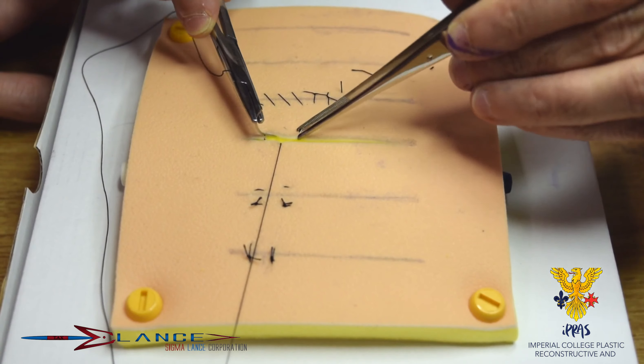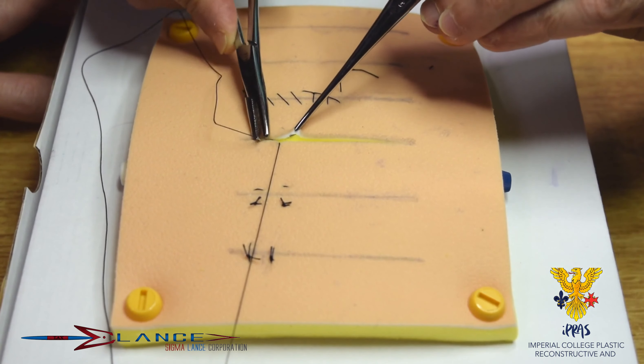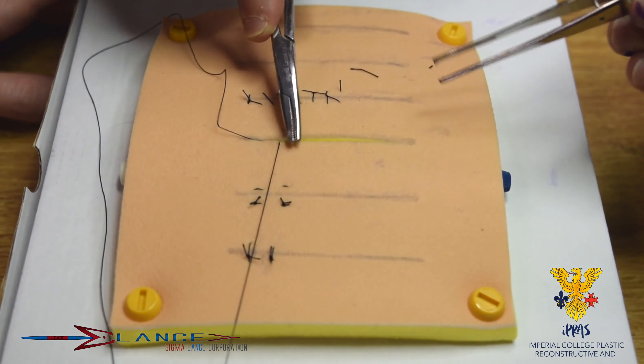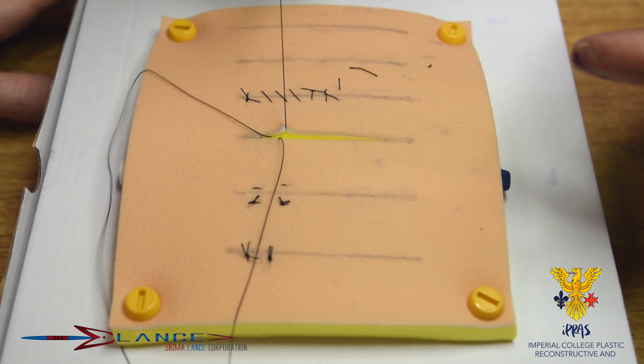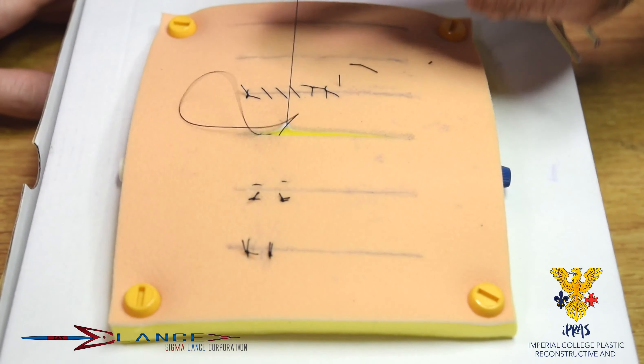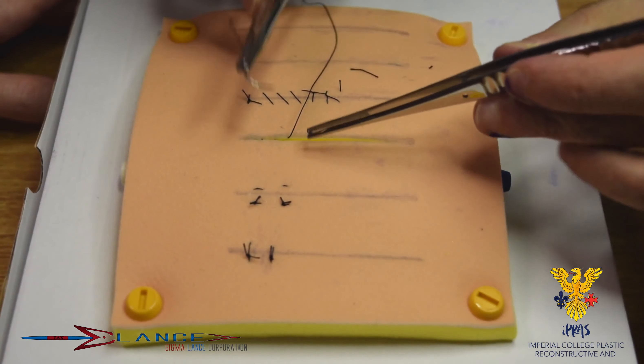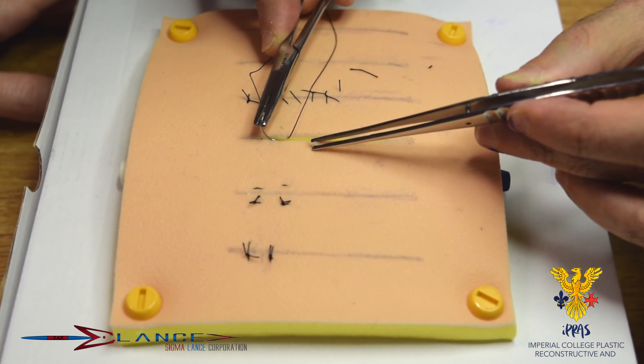And having an assistant actually is crucial for doing running sutures. And again, slightly behind.